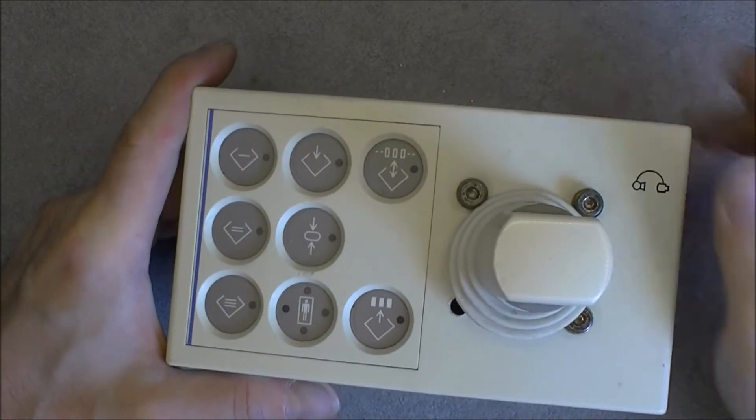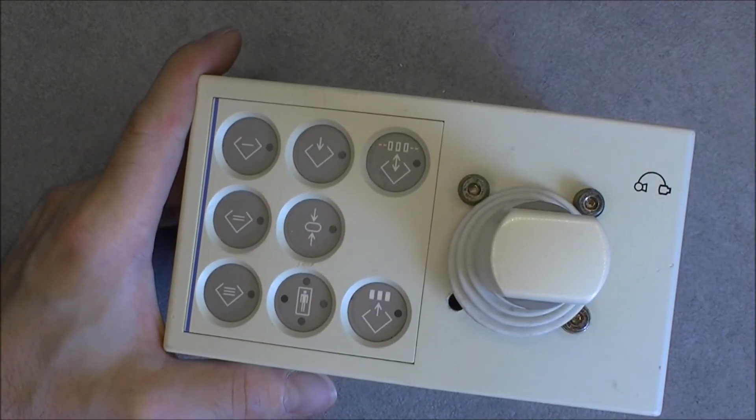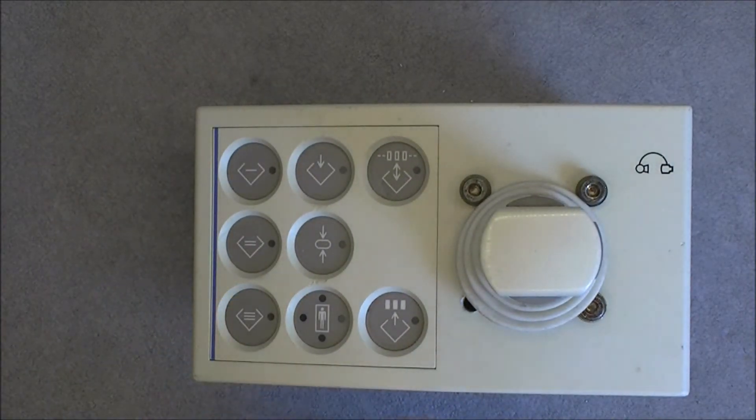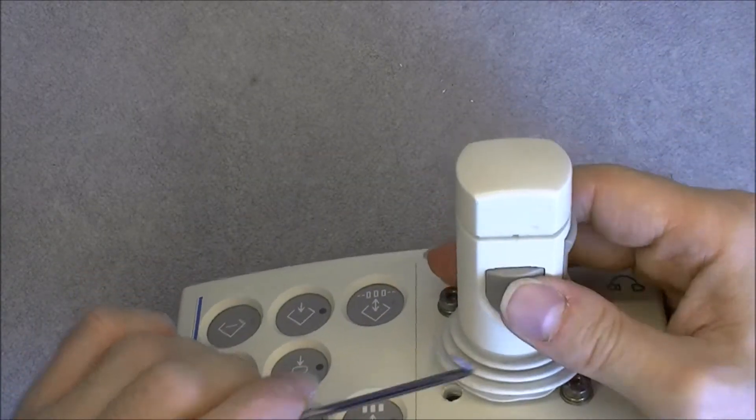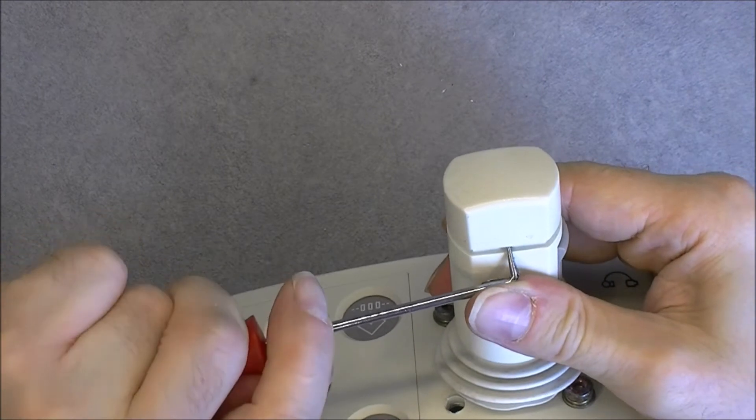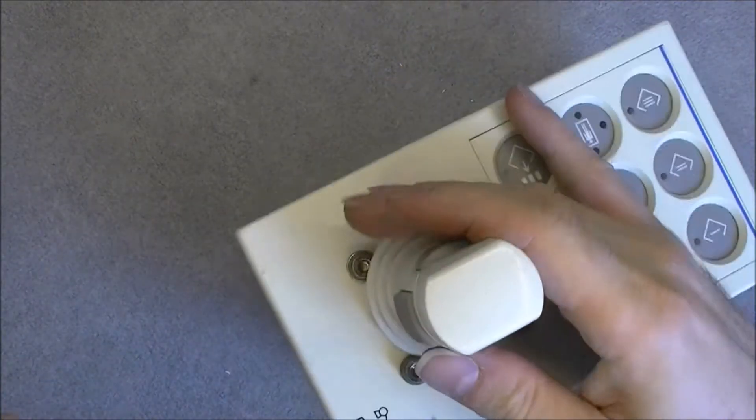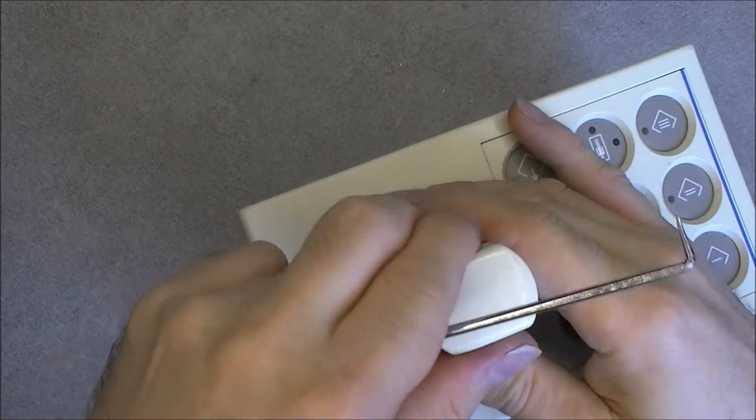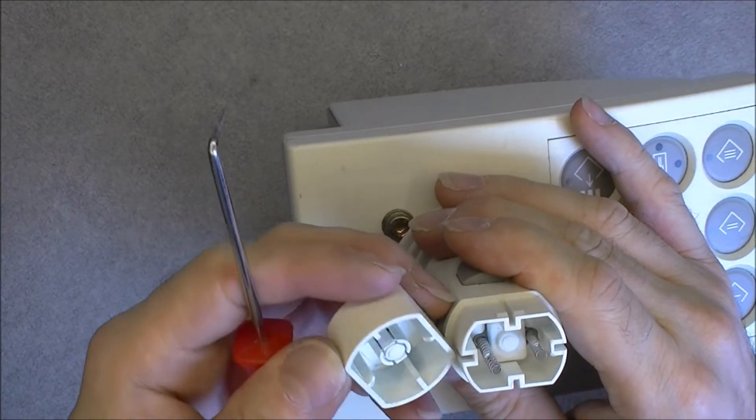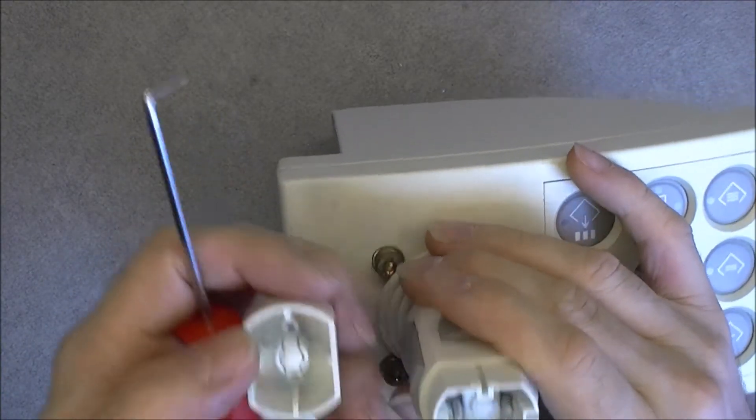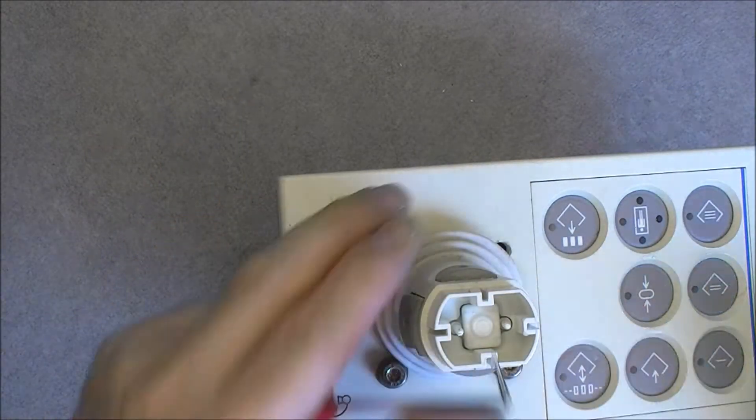We have the emergency stop button. It is a controller for the C-arm. Before we remove the bottom, I wonder if we can do anything about this thing. Maybe, it looks like yes.